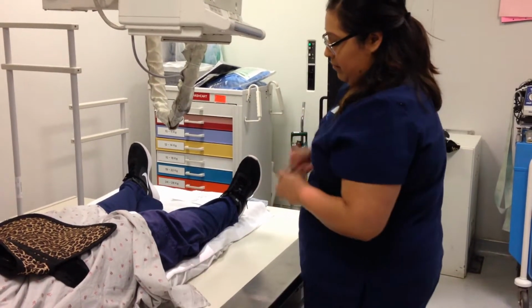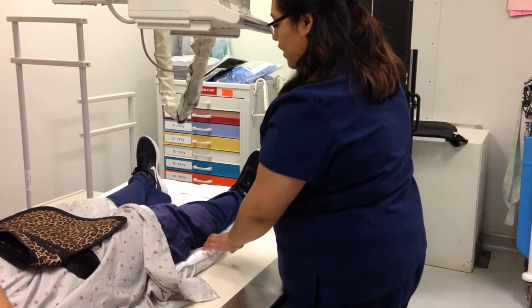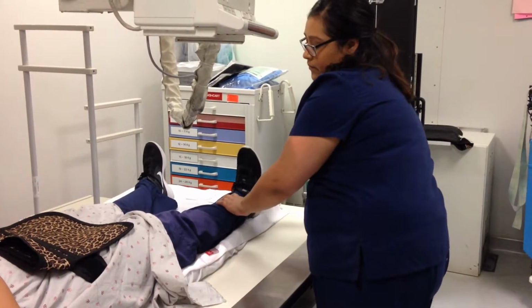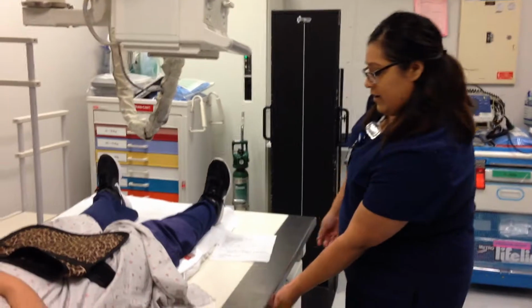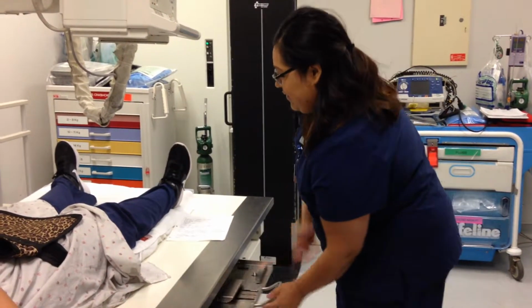We'll be needing our right marker, and collimating. Okay, hold on nice and still, okay, Ms. Garcia? The X-ray. We'll be changing out our IRs, reading it, and placing a new one in there.